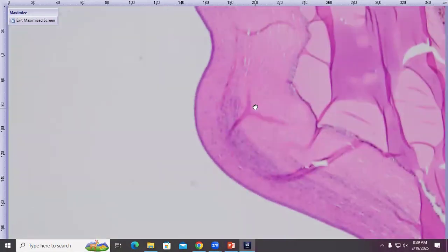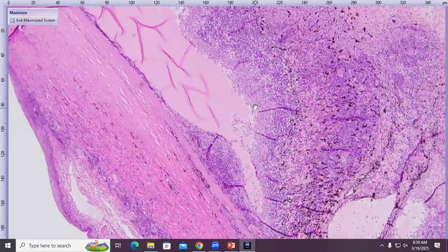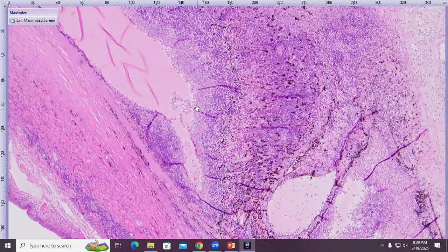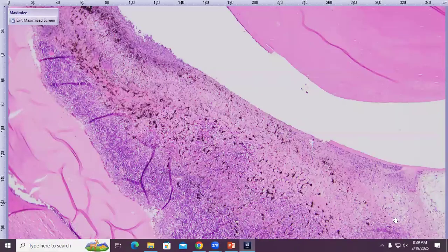So starting with the cornea, there's a little bit of peripheral keratitis and vascularization, possibly secondary to the ophthalmia. But our main event going on here is in the uveal tract. So we have the iris, it's very thickened, it's very purple, and we can see this carpet on front here. It does cross the iridocorneal angle, causing some peripheral anterior synechia as well. And it carpets pretty much the entire uveal tract. We take a closer look.